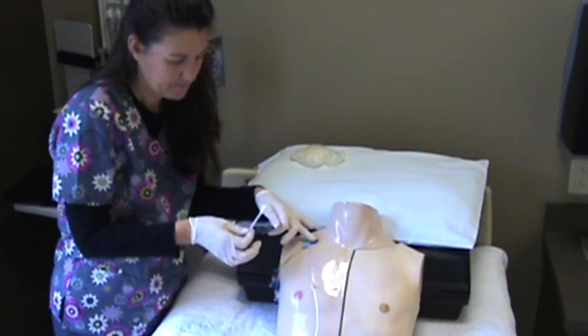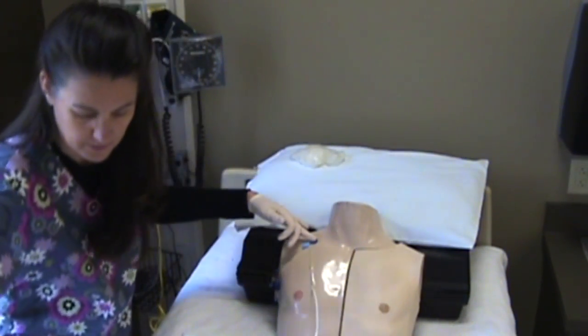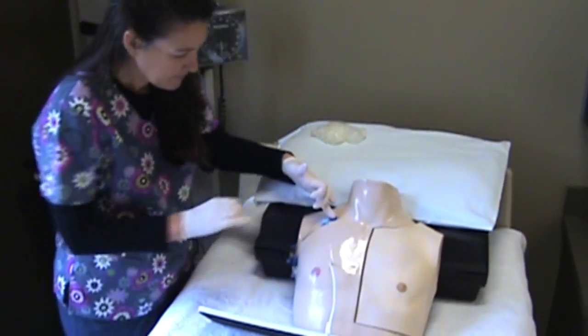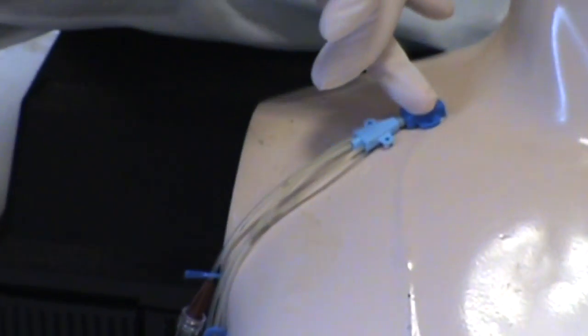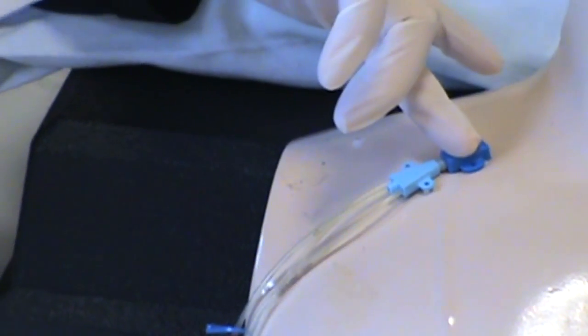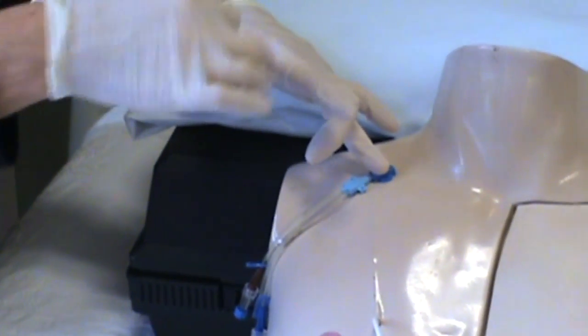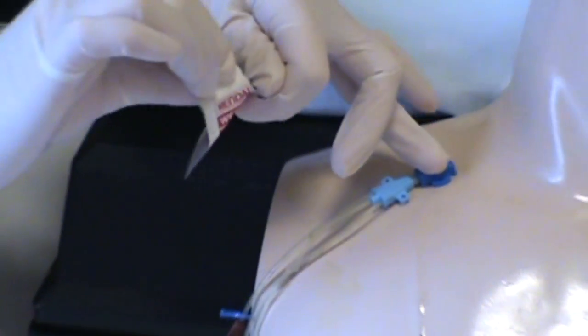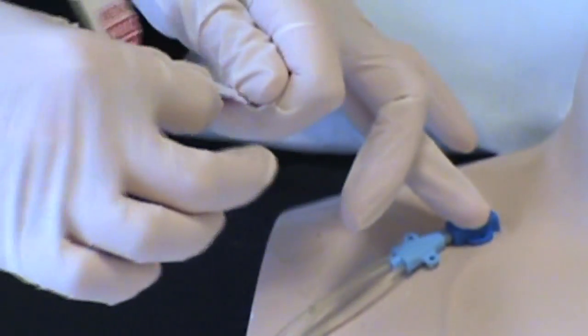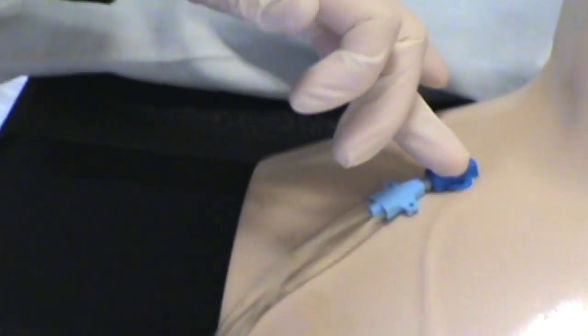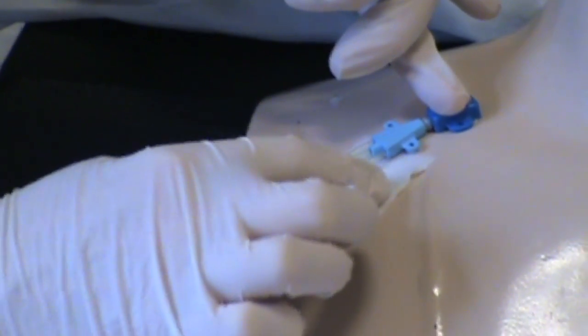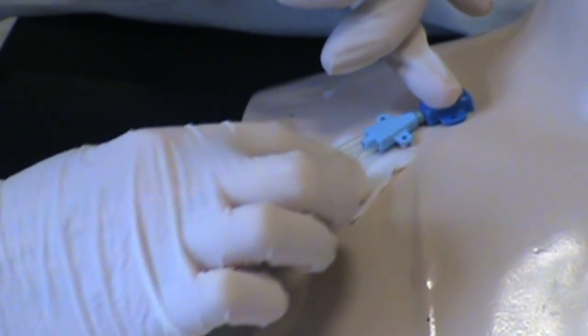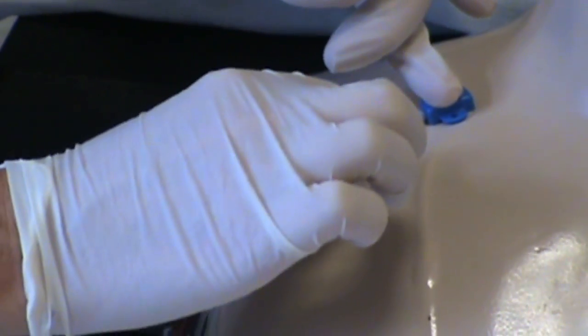I'm going to get rid of this too. Now at this point you'll see that underneath, because it's stitched in, I wasn't able to clean it. So I'm going to take my alcohol pad with my clean hand and clean under there.